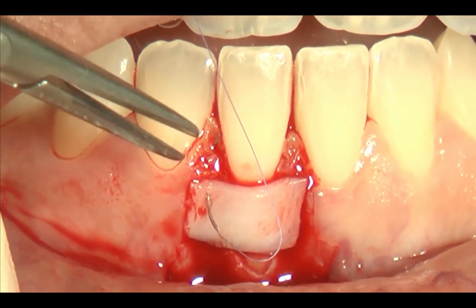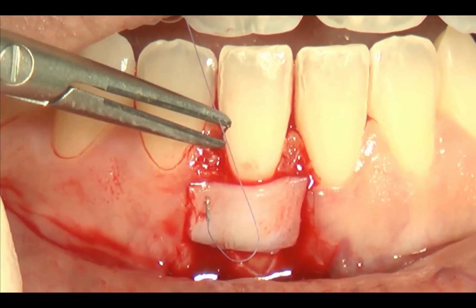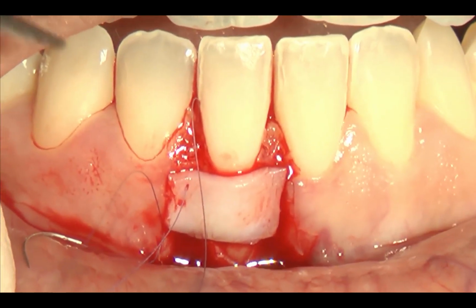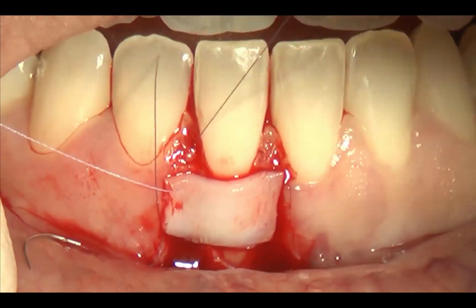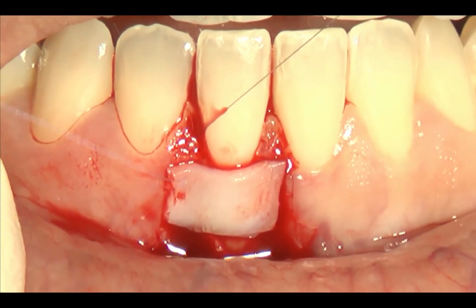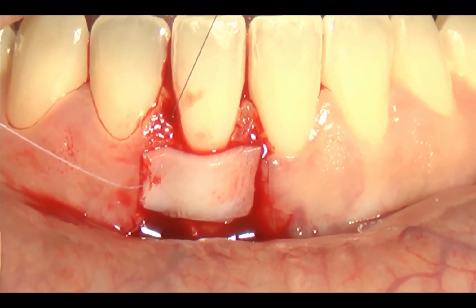You don't need to place any Emdogain before? No, because Emdogain should be placed only when you have very, very wide buccally dislocated root. In this case it's not so, let's say, yeah, you can also apply it, doesn't matter too much.